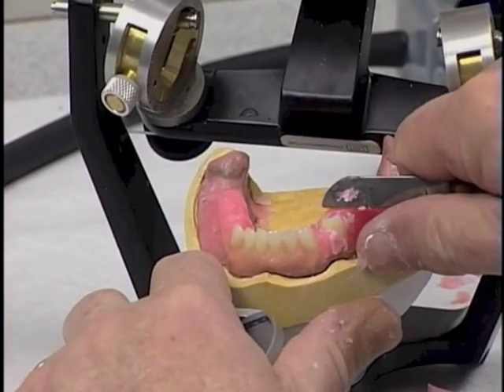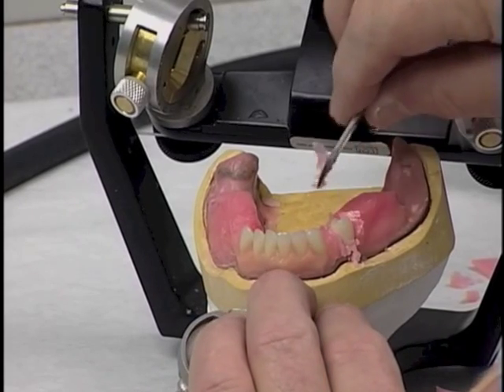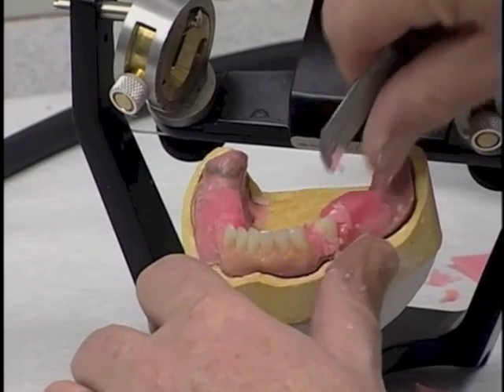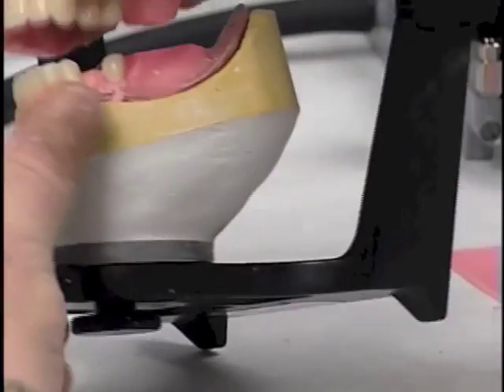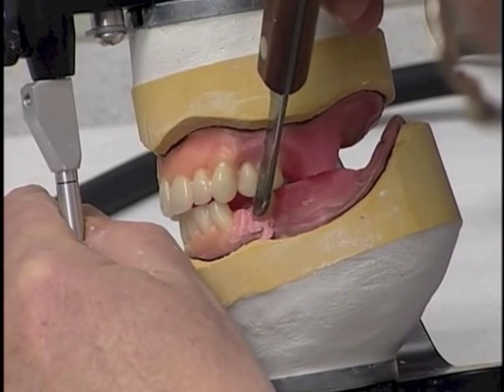It appears as though we have the correct mesiodistal position for that tooth at this point, but we do not have the cusp articulating properly yet. So what we're going to do is remove enough wax so we can see this well. And we'll see that anterior posteriorly this tooth is beginning to look pretty good.